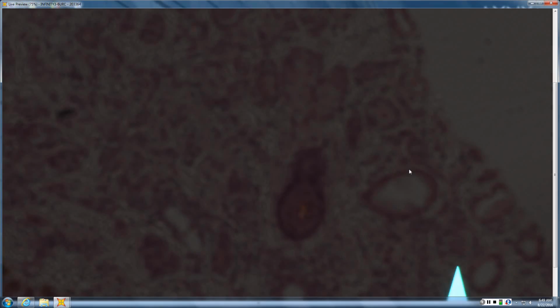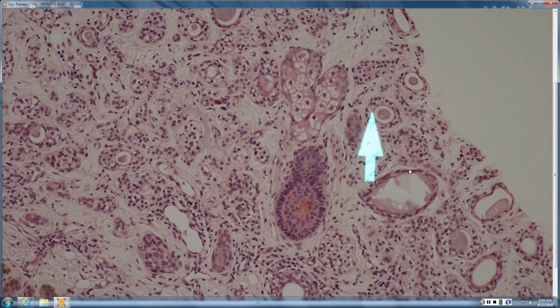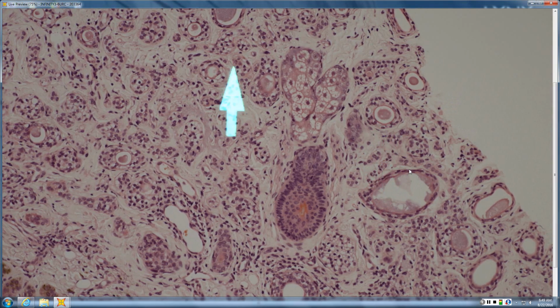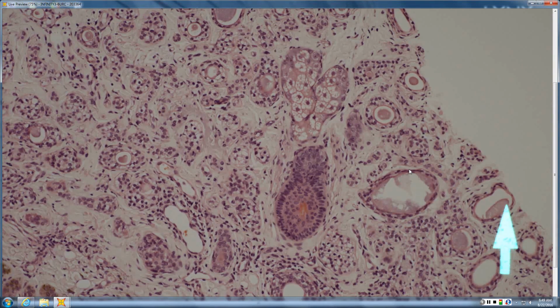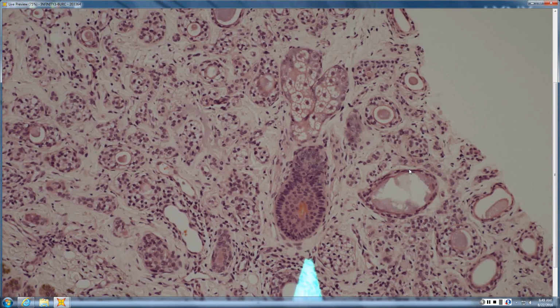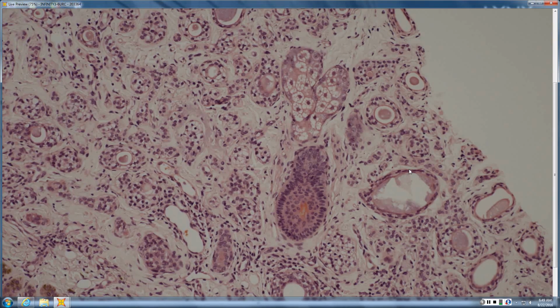And in this case, there is clear cell change, which can happen to a lot of different tumors, but certainly can happen to syringomas. And so you can see just clear cells as part of the proliferation. And these are actual sweat ducts, meaning that this is not keratinaceous debris. This is like sweat schmoo that's in here. Very technical term. There is some infiltrate as well, but it's a sweat gland proliferation, very well circumscribed, on heavily pigmented skin. And so this would go most with syringoma.